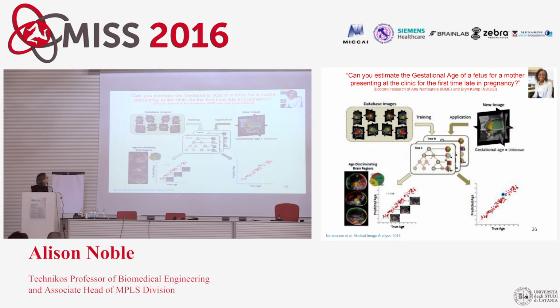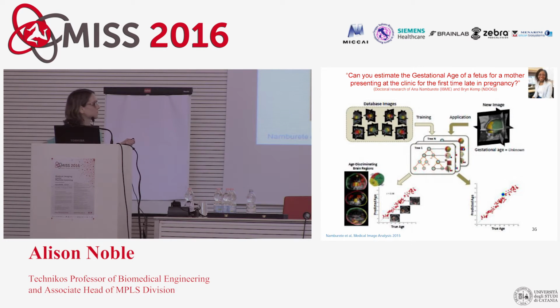And the solution that Anna worked on and came up with is the following. We used the big database I've mentioned before, the Intergrowth database. So we had a large, very well characterized database. By well characterized, I mean we had volumes at each day of pregnancy, and that allows you to think about how you could build a regression model that would map the day in pregnancy to the image acoustic patterns that you'd see in a 3D ultrasound volume. So we have this very large database, and that forms your training data set.